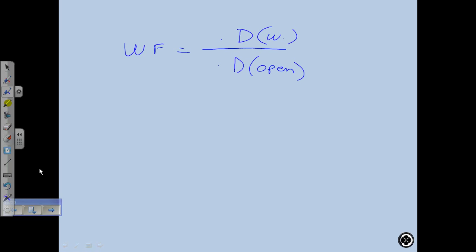Is it that the wedge is attenuating more at low energies than at high energies? Correct, exactly. The relative difference between these two is higher at low energies than at high energies. At high energies, the wedge doesn't attenuate as much because the energies are more penetrating. They don't interact with the wedge as much as low energies. What about field size?